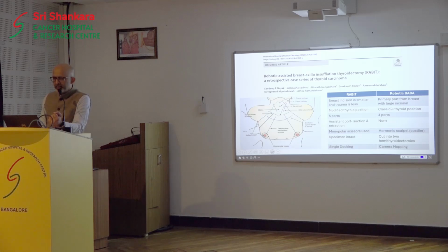So we went on from the basic BABA, which I used to do, to seeing what would be the best. I did not know that robotic BABA existed. It was not very published at that time. So in 2016 or around that time, when I wanted to get into it, this is how we started off. There are differences, of course. They do two hemithyroidectomies, and there are many differences which I have highlighted in my paper as well. The technique is similar to the endoscopic BABA: bilateral breast approach, bilateral axilla incisions, and there is an assistant port which I have in the right.